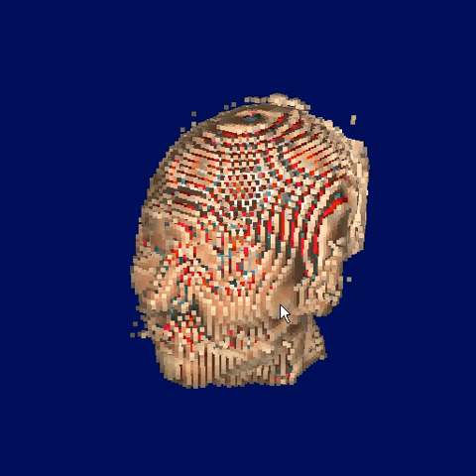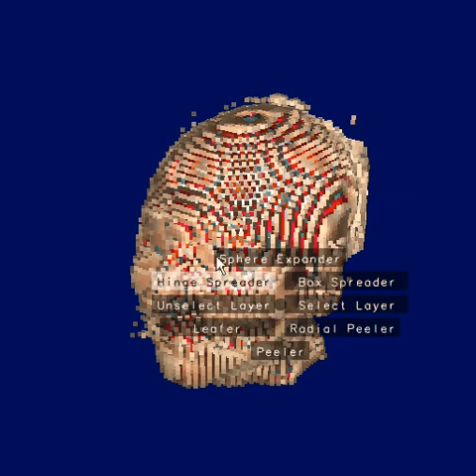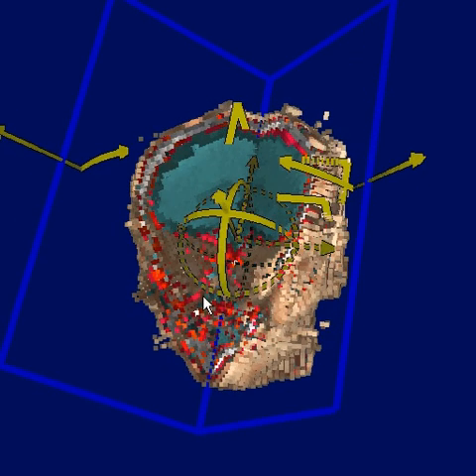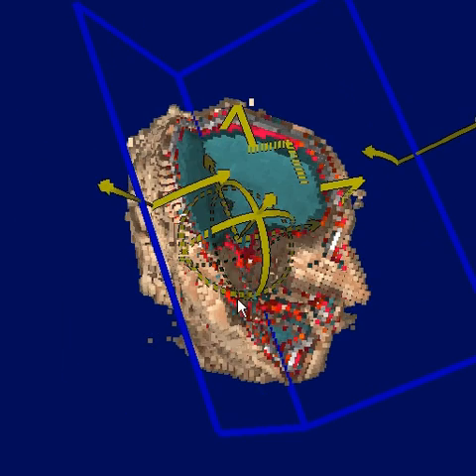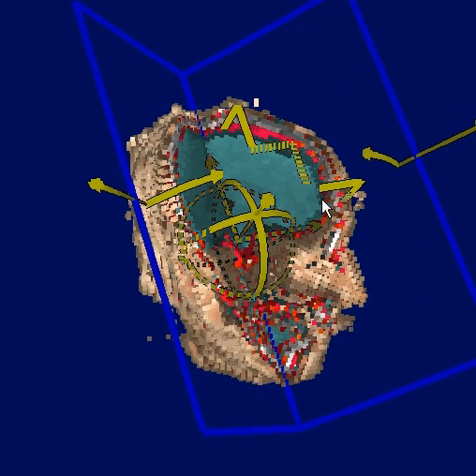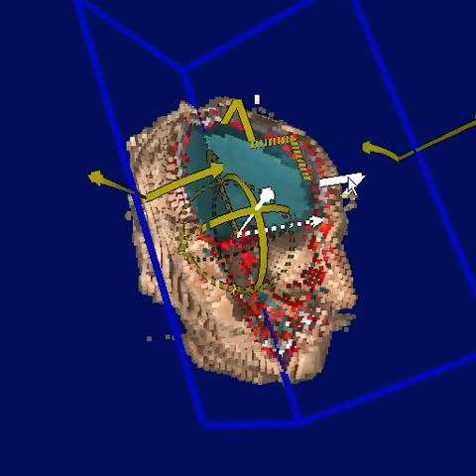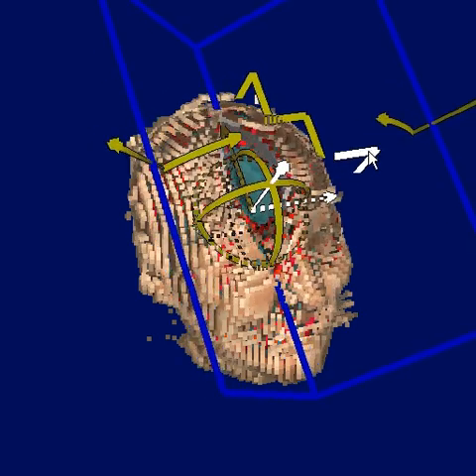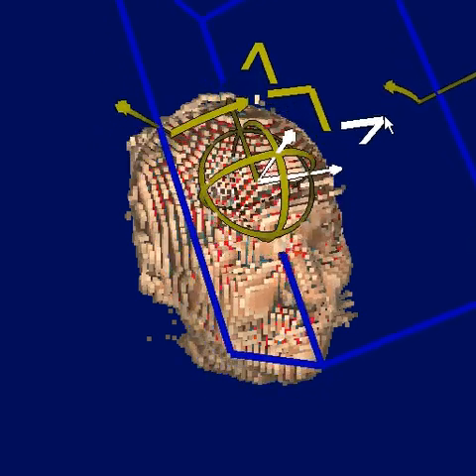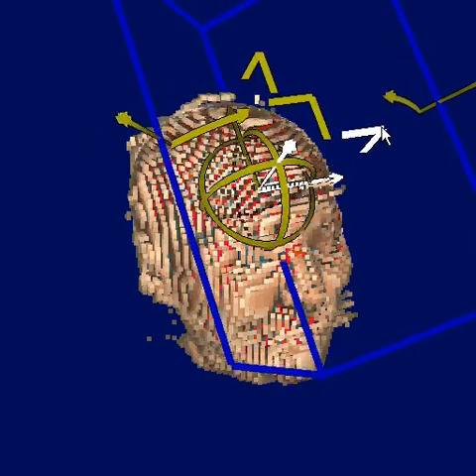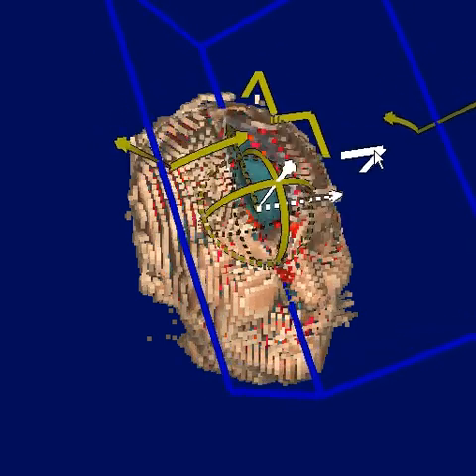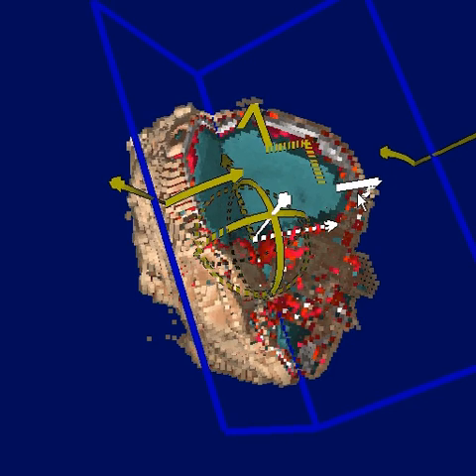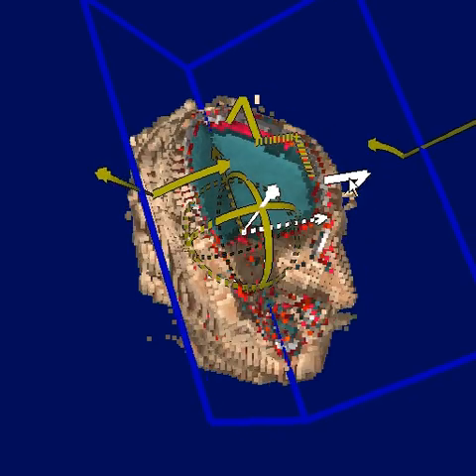Here we have some volumetric data. I can pop up a radial menu and select the hinge spreader tool. This is a tool that cuts into the volume and pushes voxels to the side. As you can see, when I plunge the hinge into the data, none of the voxels are actually being removed. They're just being displaced.